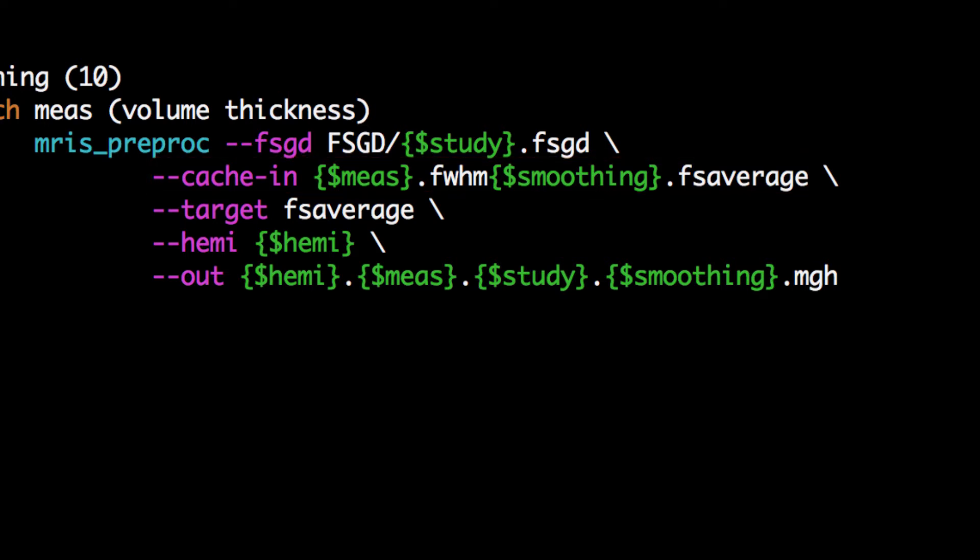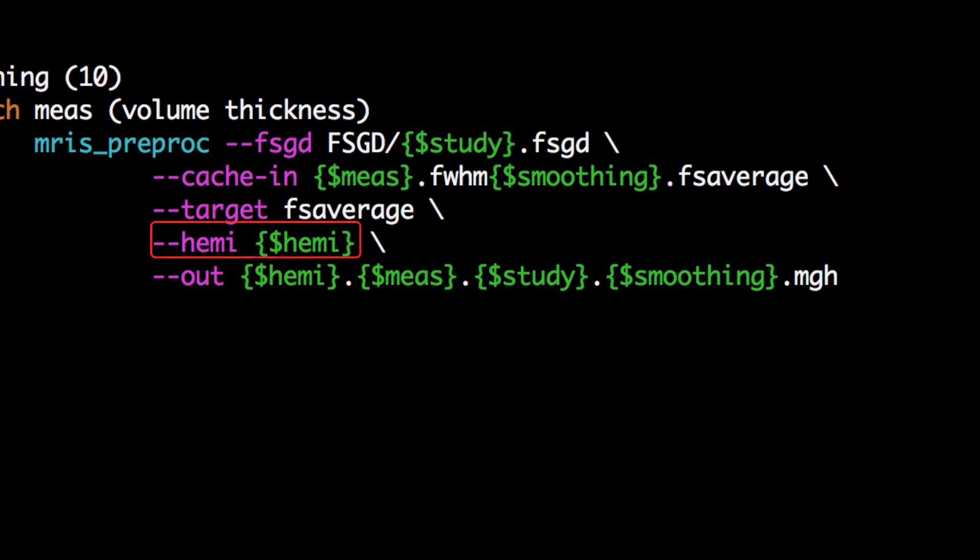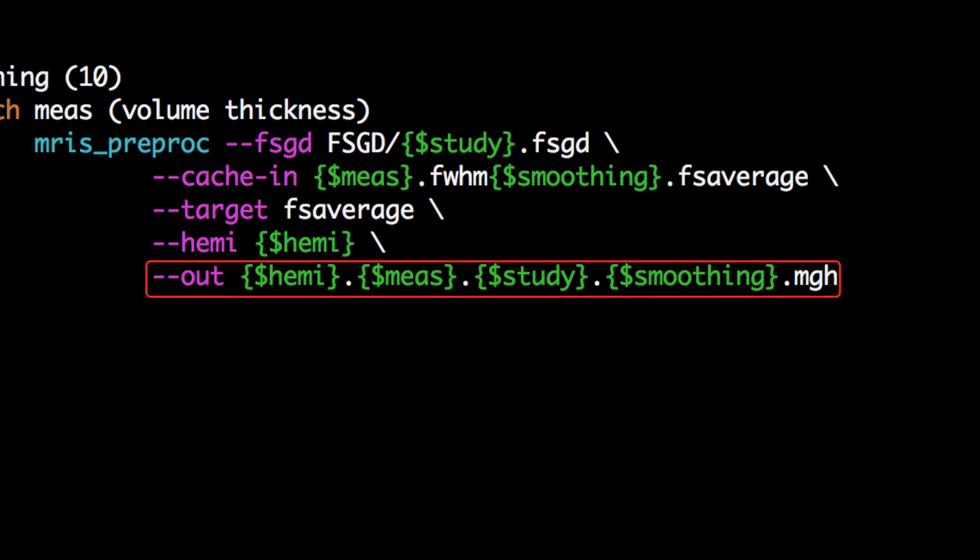We tell it that all of the images have been resampled to the FSAverage template. We then specify which hemispheres we wish to create group maps for and specify the output file.